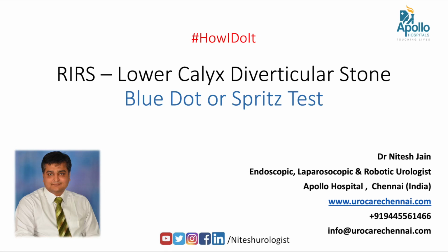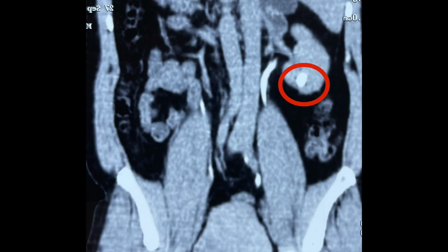Hello everyone. Today I'll be talking to you about RIRS for a lower calycial diverticular stone. The CT scan was suggestive of around 1.5 cm lower calycial stone, but diverticular suspicion was created because of the loss of parenchyma adjoining the stone.